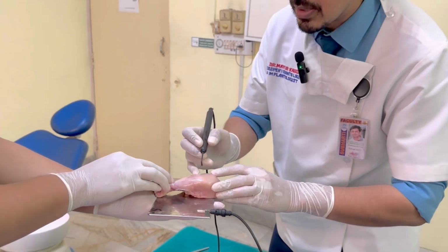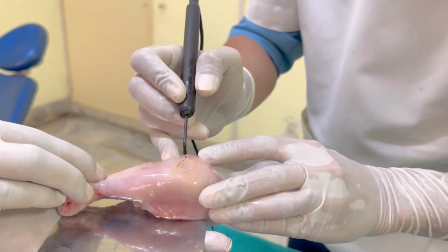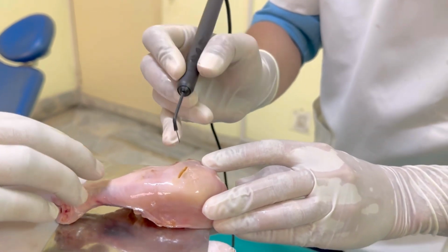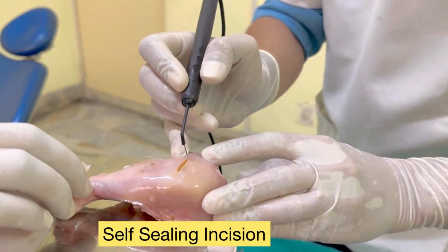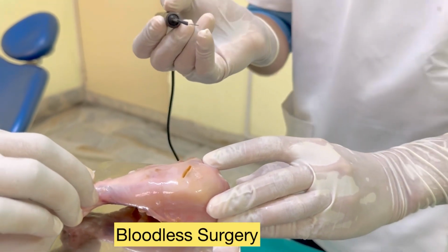So electrosurgery incision is basically fast, some amount of smoke is produced, but ultimately it is a self-sealing incision. So what do I mean by self-sealing incision? No blood would be there.